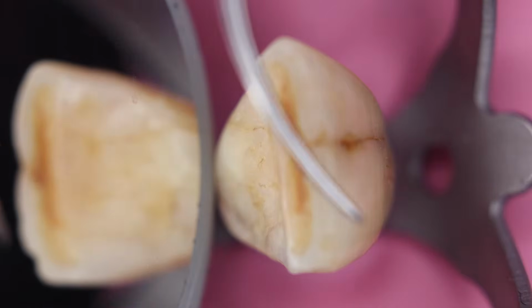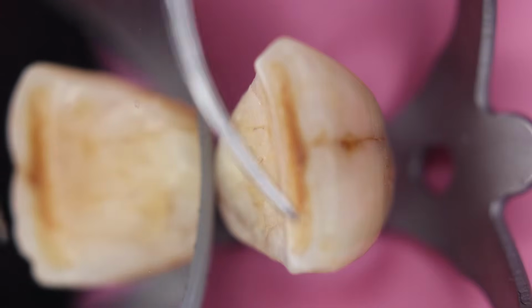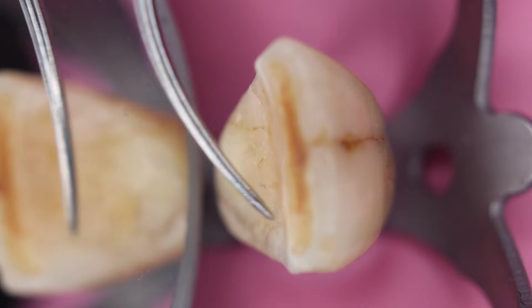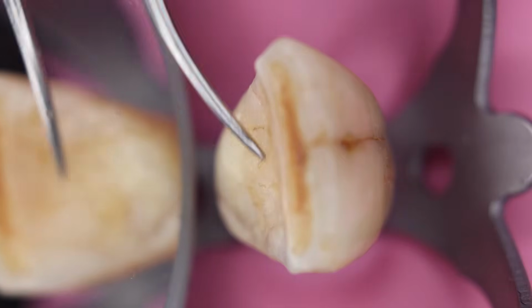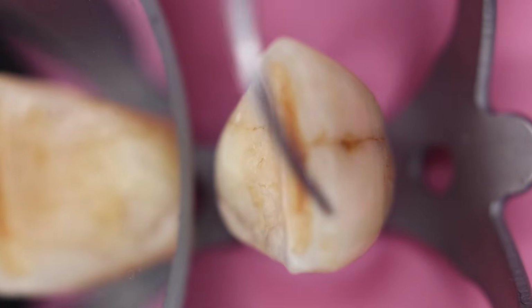And the second thing is, we are going to see this tooth in indirect vision. So never approach it in direct vision unless there is a considerable loss of the incisal edge and the anatomy of the lingual or palatal aspect is completely destroyed. In that case, we need to approach from the labial aspect.